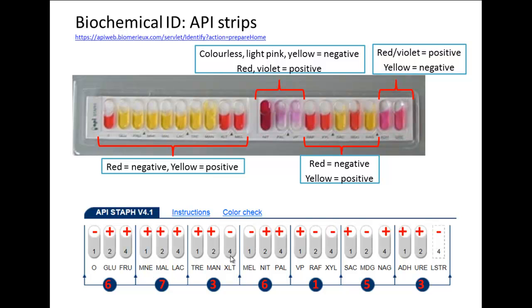In years gone by, we would have had a book to look up this numerical barcode. But now, in the age of computers, we have a database where we can insert the positive and negative scores and get an identification for the organism and see how good that identification is. The last test is not on the API strip — it's a lysostaphin resistance test done in the laboratory, scored as negative. So we have our barcode here.